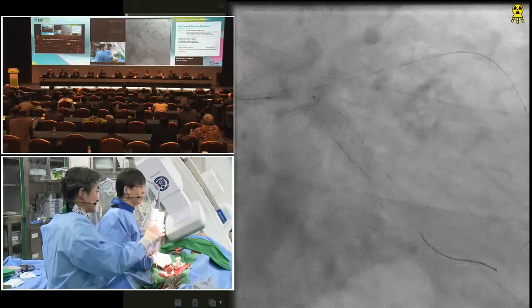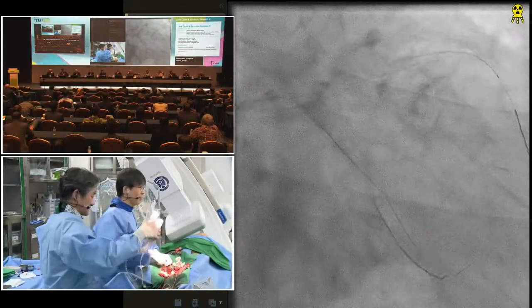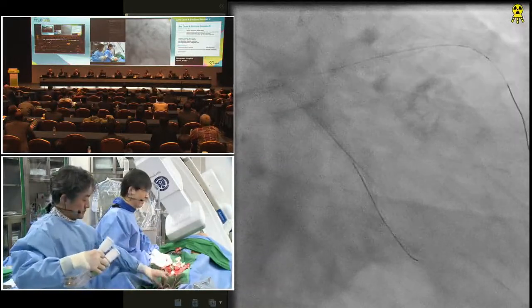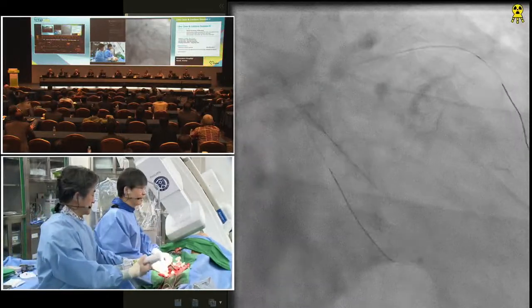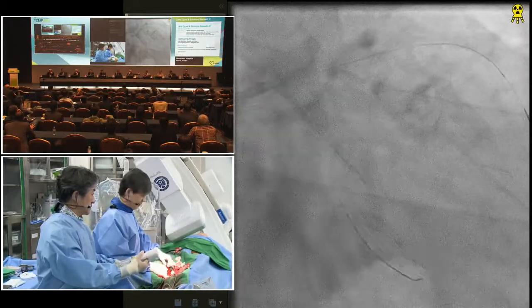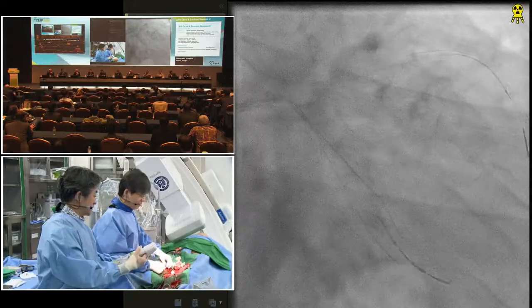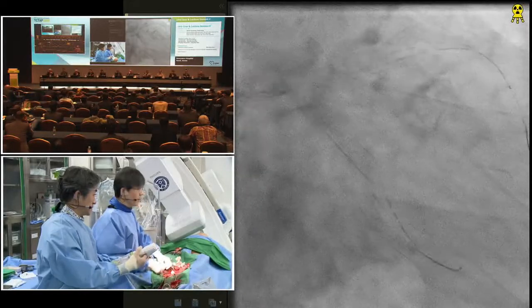You are right. Okay. Let's check it. Let's prepare the IVUS.